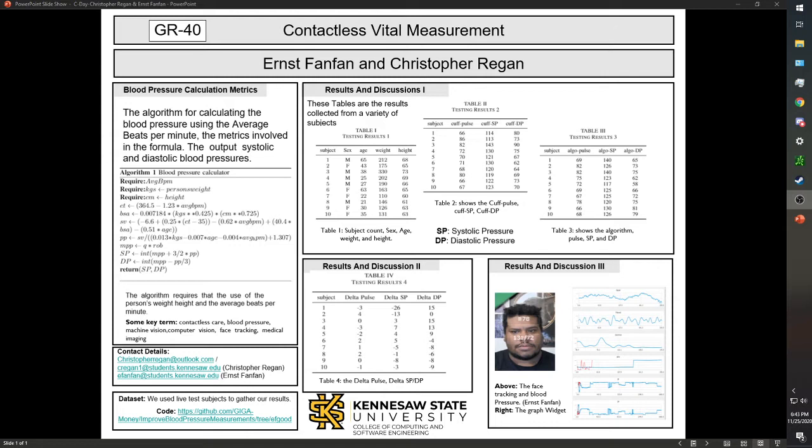There's been an expanding need to have these measurements before in-person visits at doctors, with measurement calculations growing and being wanted. Previous applications were able to take visual data, capture the beats per minute, and display that back to the user. However, if you want to grab a more valuable piece of information such as the blood pressure, you need a little bit more information.